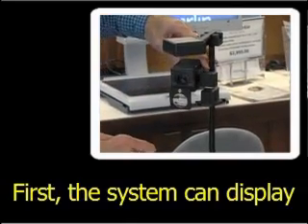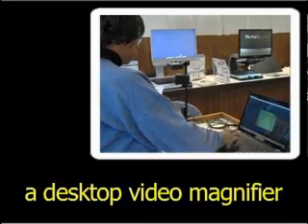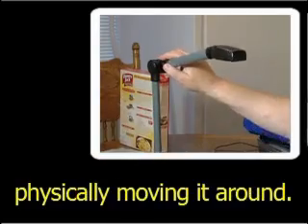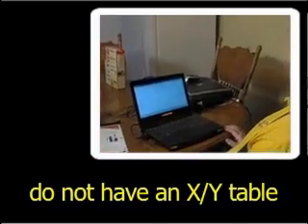First, the system can display an image in the same way as a desktop video magnifier by placing the material to be viewed directly under the camera and physically moving it around. These systems generally do not have an XY table.